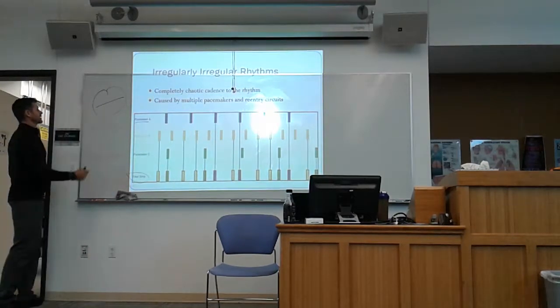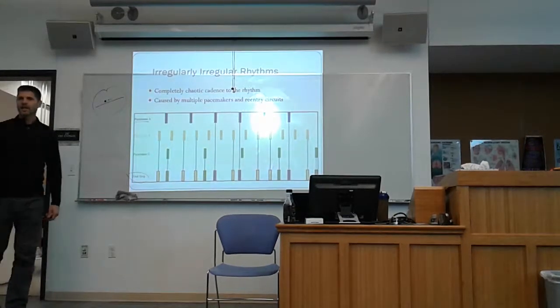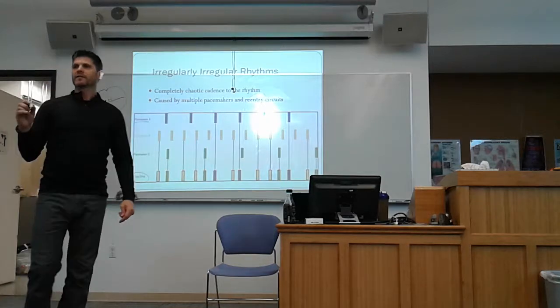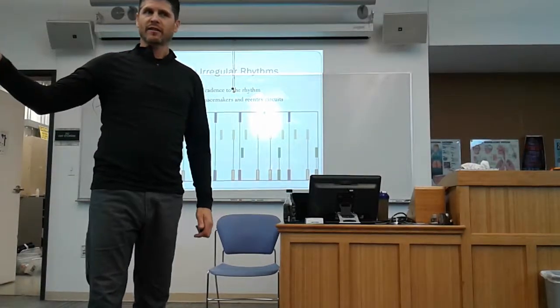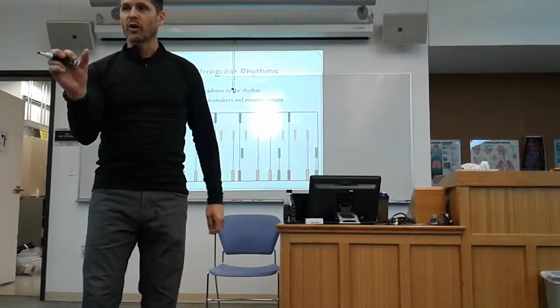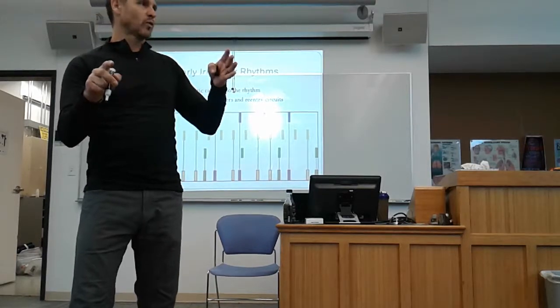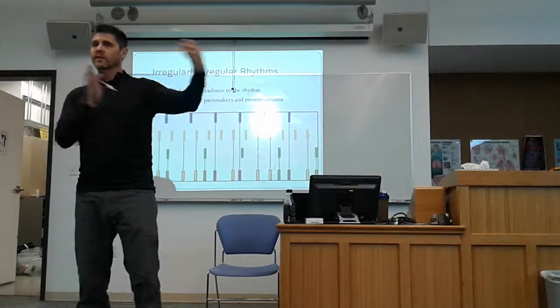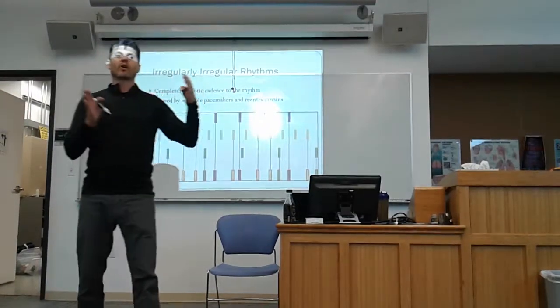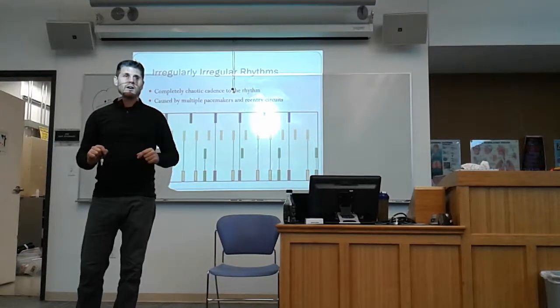So imagine, just for a minute, here's what we have. There's my AV node. You all understand that the AV node is the thing that is going to initiate the QRS, yes? It's not the start of the QRS, but electrically, after it leaves the AV node, that's where it's going to be set for the QRS, right? So the AV node has control over what's going to happen to the QRS. So our question in this particular case is, what's happening before the AV node?